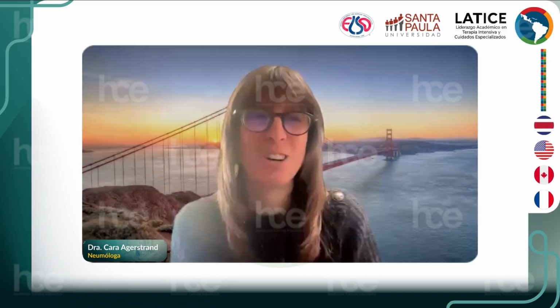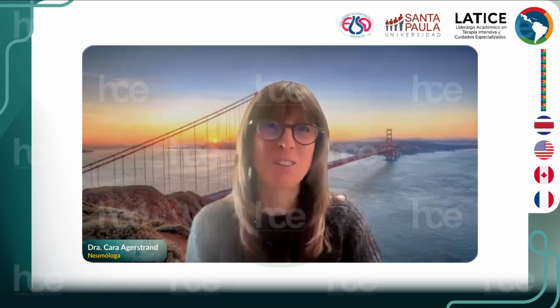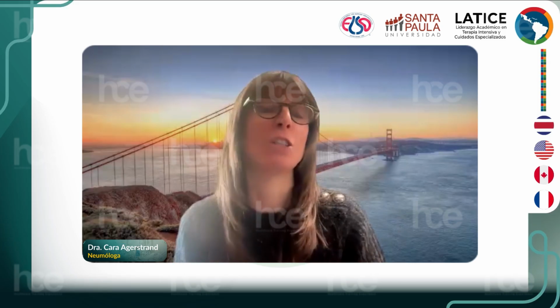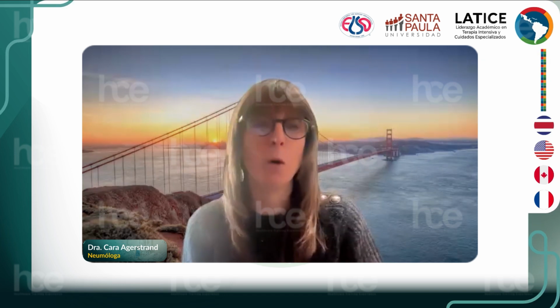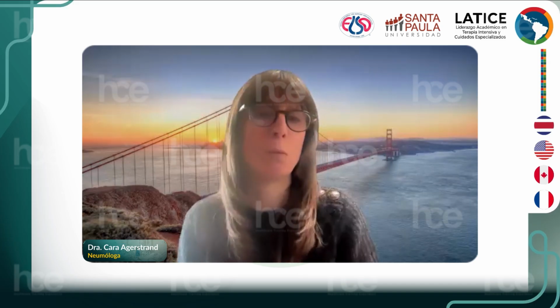There's a question here. Is there a limit of BMI for ECMO cannulation? I would say no. Based on our understanding of ECMO over the last 15 years, I think we've seen that envelope be pushed to different degrees. And I think the greatest evidence out there suggests that people who are obese, even morbid obesity, super morbid obesity, very high BMIs can do quite well on ECMO.